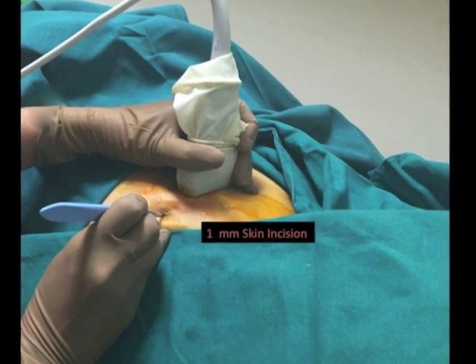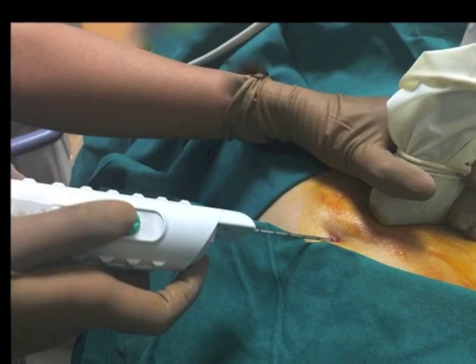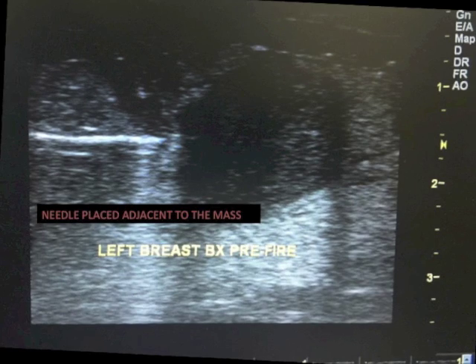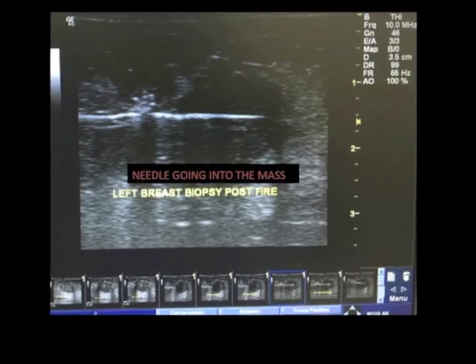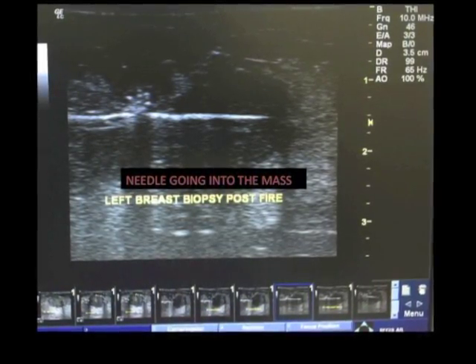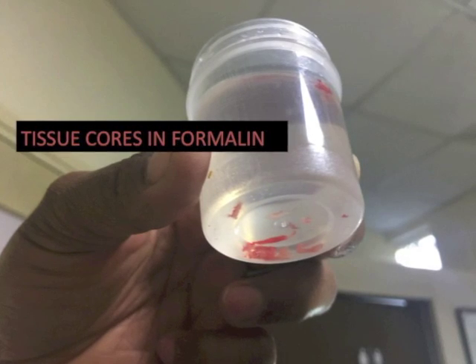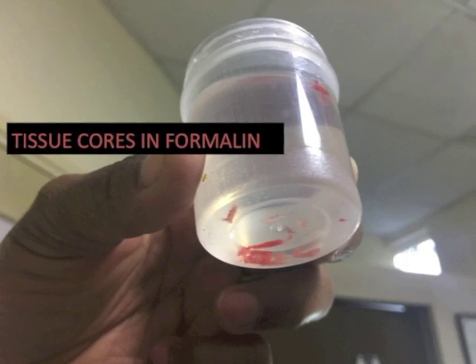An 11 blade is used to make a small nick in the skin to allow the biopsy gun to be introduced. In the pre-fire position, the needle tip should be placed just proximal to the area to be sampled. This image is documented. The needle is then fired with the push of a button. When the needle fires, it cuts and collects a 2 cm long thin piece of tissue. This is the post-fire image that should also be documented. About 4 such tissue cores are obtained from the lesion sampled. These cores are then placed in formalin.